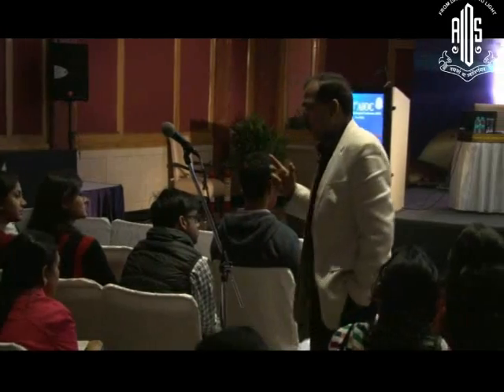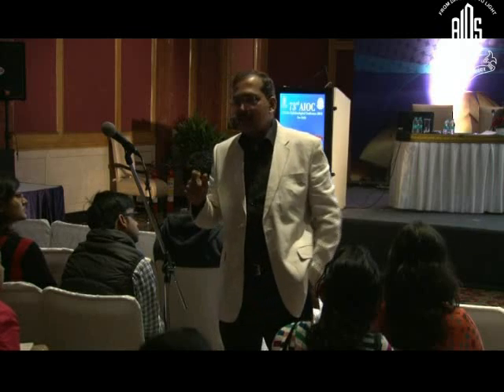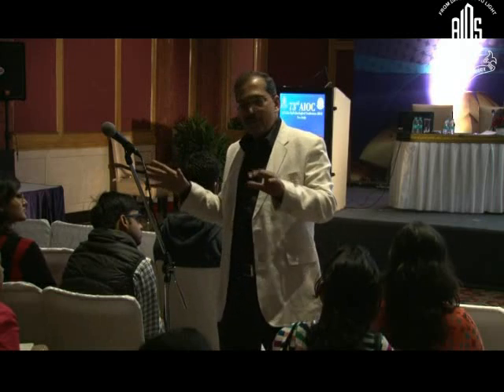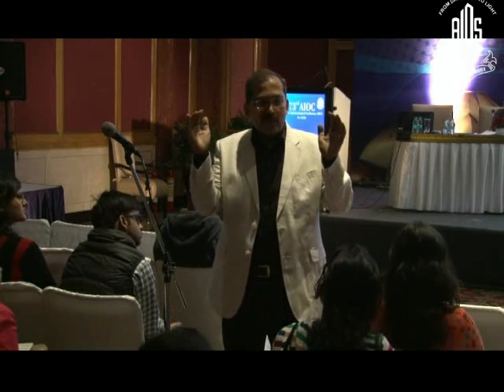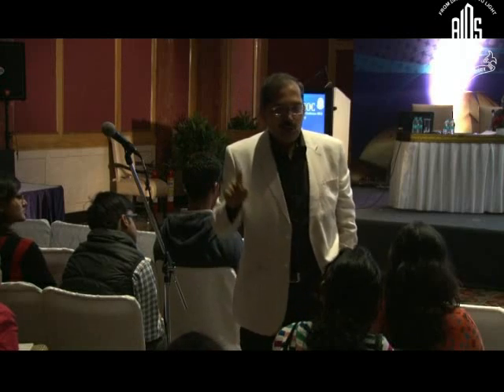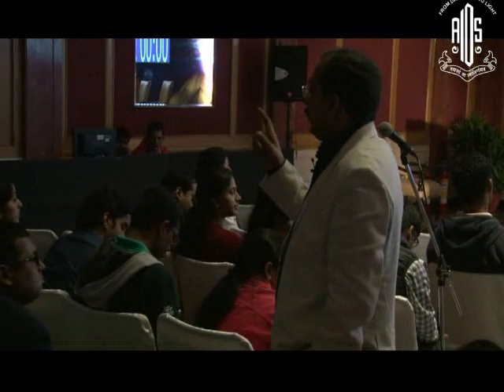But there is a hitch to decreasing the optic zone. If you decrease the optic zone, you should always see what happens to his pupil at night. Imagine his pupil is 6.5 millimeters at night, what we call the scotopic pupil diameter. Then that pupil will be much bigger than the treatment zone, and he will have a lot of photic phenomena, glare, halos, and all the problems at night. So the treatment zone has to be larger than the scotopic pupil. You cannot reduce the treatment zone beyond a point.